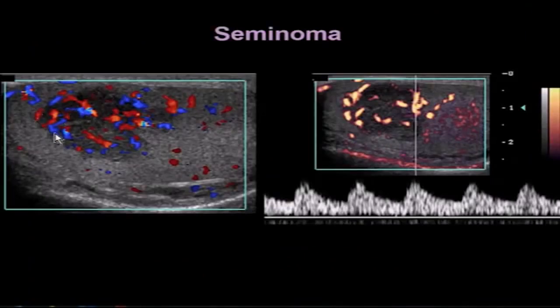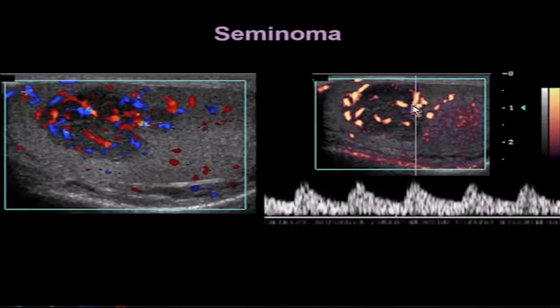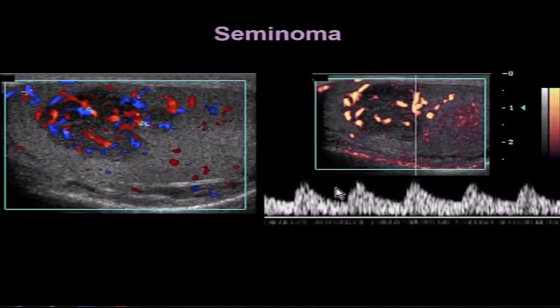Here is a seminoma. You can see a hypoechoic mass in the testicle surrounded by normal testicular parenchyma, and the blood flow inside the mass is greater than in the surrounding parenchyma — so it's hypervascular. When we put the Doppler gate over an artery traveling through the tumor, we see low-resistance flow, typical of a testicular tumor.